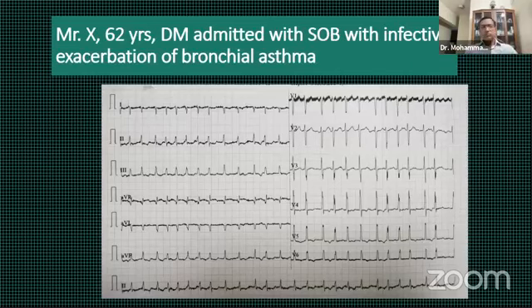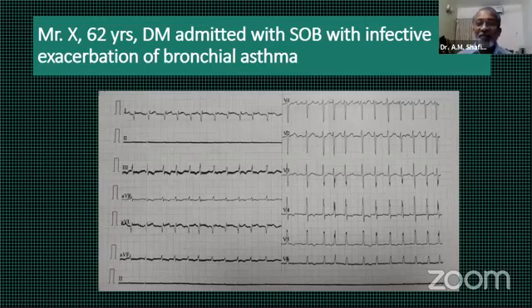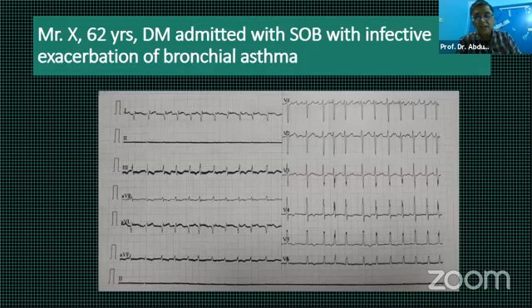Then this is another ECG of the same patient. Go back to the first one. Okay, sir. Look at this. Whenever you get negative complex in lead 1, be sure you get it in lead AVR as well. Lead 2 is not seen here. Sir, I see an almost straight line.